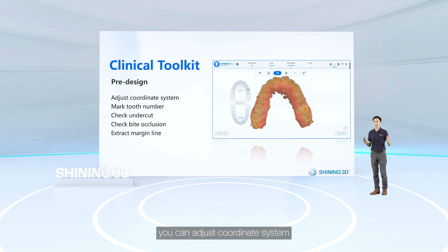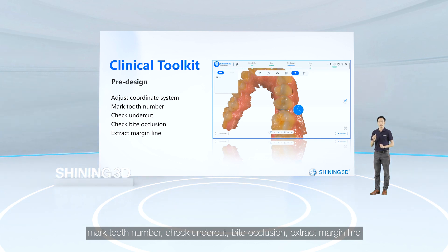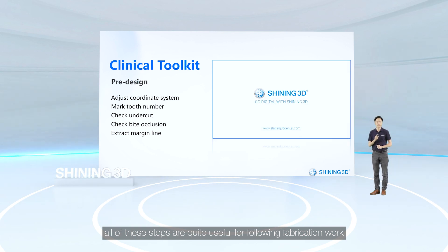The clinic toolkit module is also worth mentioning. You can adjust the coordinate system, mark tooth numbers, check undercut, bite occlusion, and extract margin lines — all quite useful steps for following fabrication work.